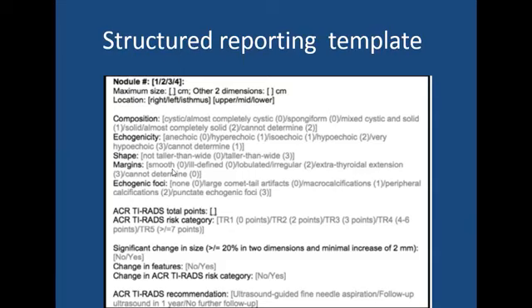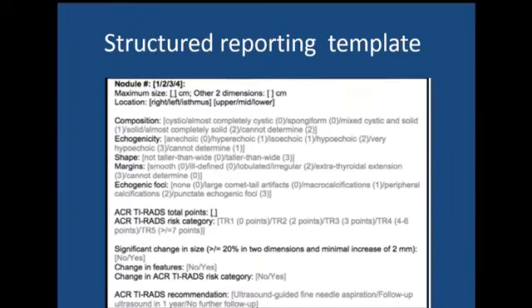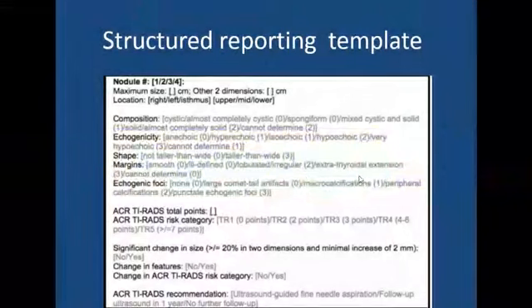The TIRAD brings us a template for the report, and actually I do believe that this report makes us all work in the same frame, in the same way. Before, if I scanned a patient and we had a nodule, I would just start to describe it, and maybe I would recommend FNA, and sometimes even my colleague could recommend nothing at all.